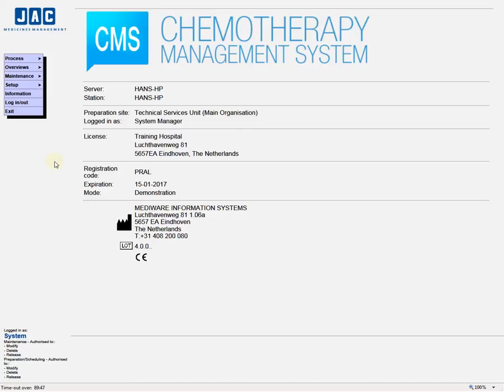Welcome to the training Creating Therapy Protocols in CMS.